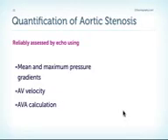So today, echo is really the gold standard and reliably can be used to quantify aortic stenosis. And we have to assess the mean and maximum pressure gradients, the aortic valve velocity using several Doppler windows, and finally we can calculate the aortic valve area reliably in echo.